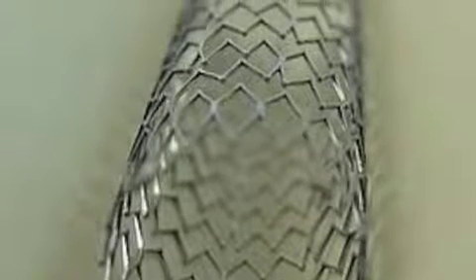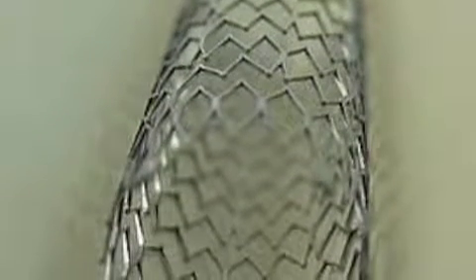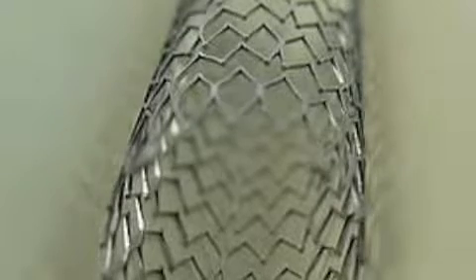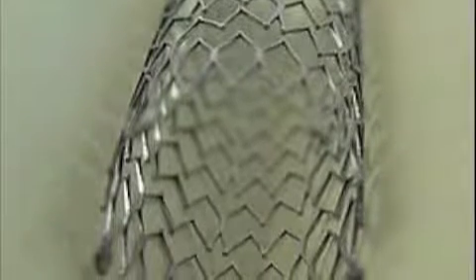The last option for an interventionalist is a bare metal stent. These were around prior to drug-eluting stents, but serve the same purpose, to restore blood flow to a previously occluded area. Also, they are exactly as they sound, a piece of bare metal. There'll be no medication coating on these types of stents. The patients will also have to go on the antiplatelet therapy with this type as well, with medications such as Plavix, Brilinta, Effient, and aspirin.